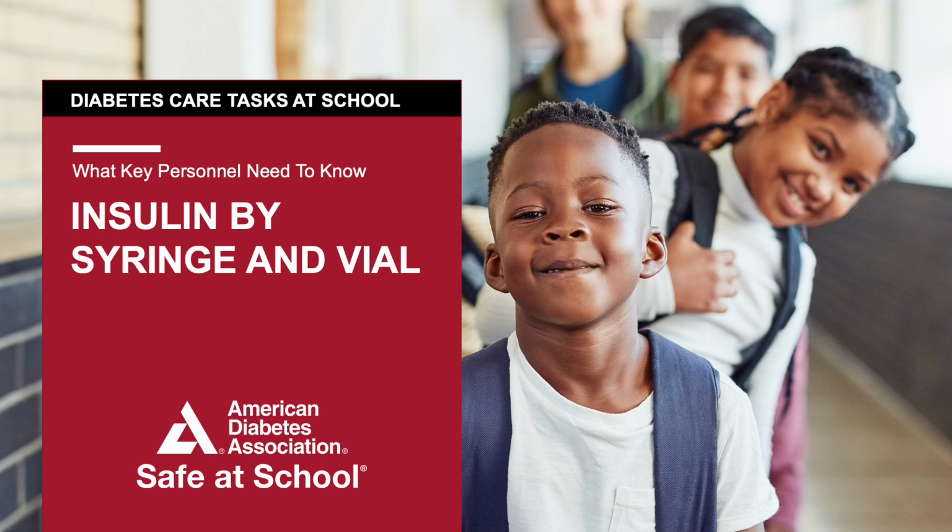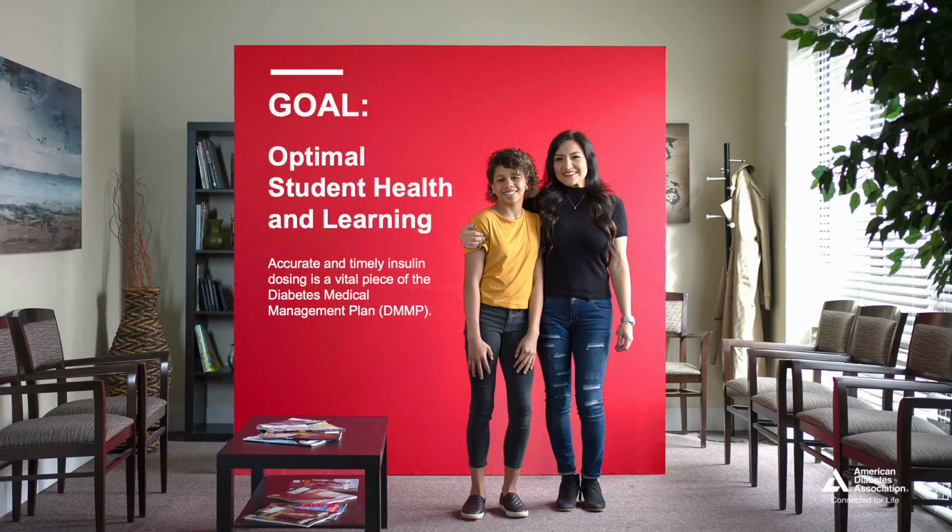This presentation is not intended to provide legal or healthcare advice. Please consult with a legal or healthcare professional regarding your specific questions or needs. Each training component was created specifically for school nurses and other qualified healthcare professionals to train school personnel. This unit is insulin by syringe and vial.